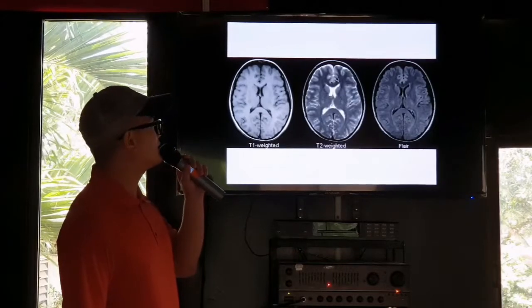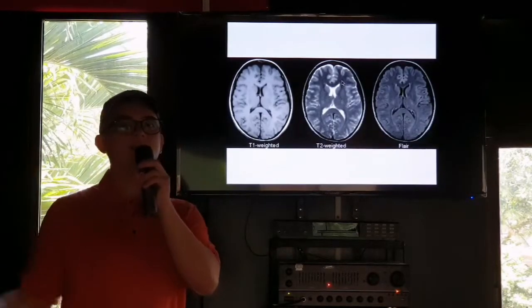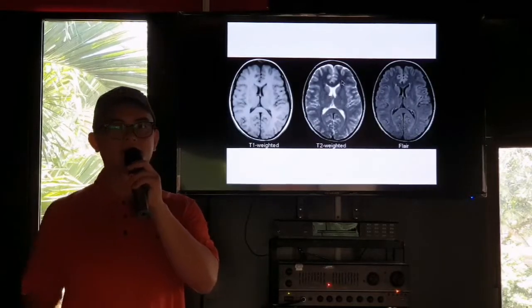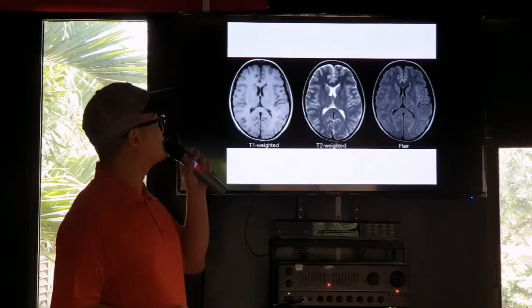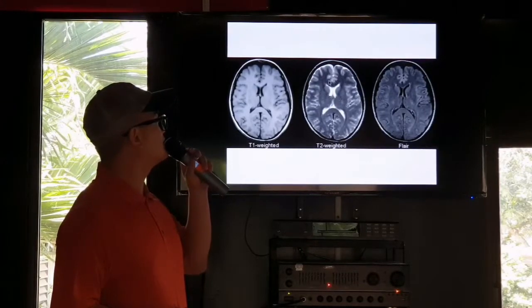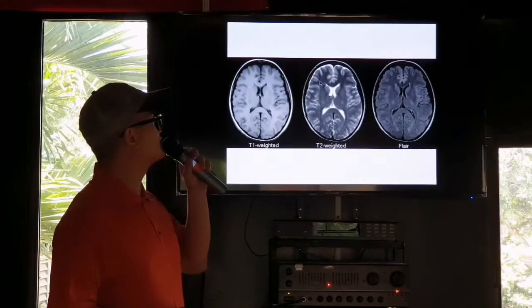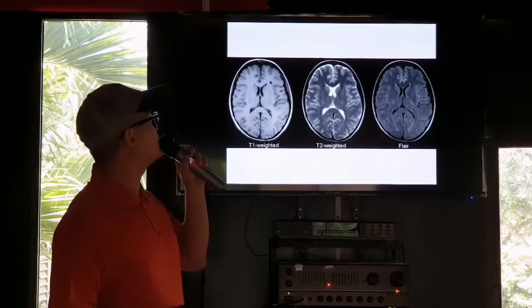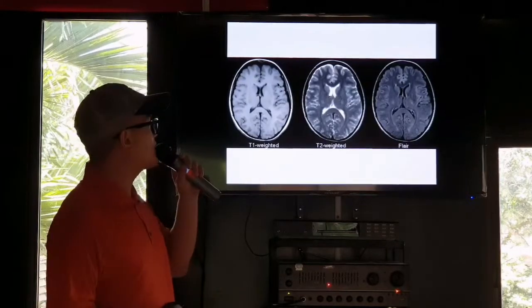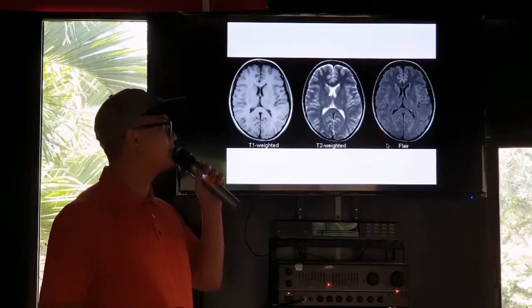Remember, what is on the surface of the cortex? It is gray matter. On the inner part is the white matter. So see, here there's a surface of gray, which is the gray matter, and the darker area here corresponds to the white matter. And of course, we also have FLAIR sequences.